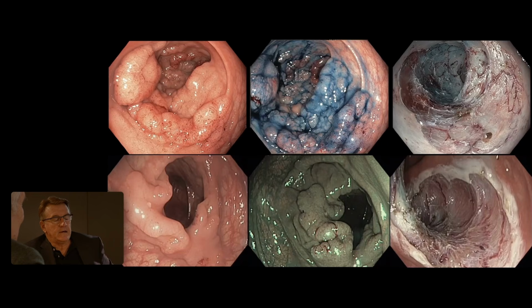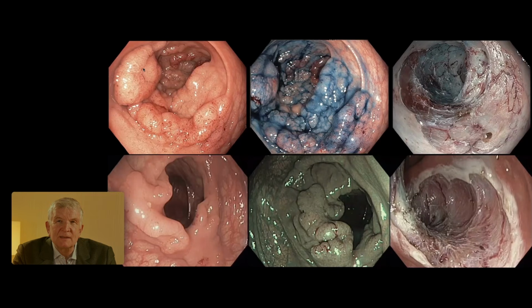Yeah, so obviously, these are two lesions assessed in parallel on the one slide here. When we do a procedure, often when people come to our department, they say, "What's going on? I see 50 pictures." We take lots of pictures, so I just synthesized this down to what's necessary to present in the slide. But this is a comparison between granular and non-granular lesions, both in the transverse. And you can see this is mostly a 2A granular lesion, pretty bulky on the left side. It is bulky, yeah.